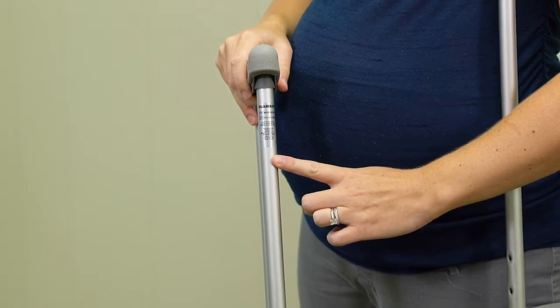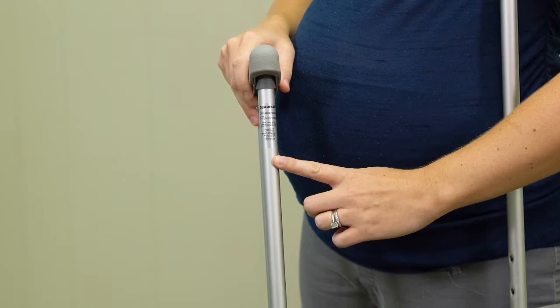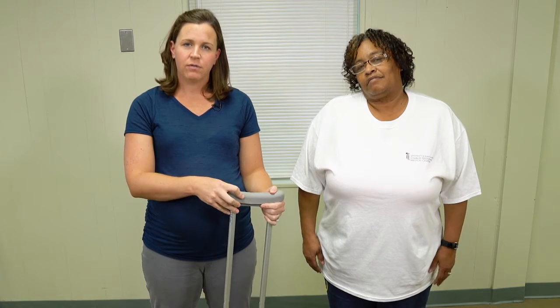Your healthcare provider will help you choose the proper size crutch and help get you fitted. So it's very important to get the crutches sized properly for each patient. If you are the patient adjusting them for yourself, the caregiver adjusting it for the patient, or a healthcare provider adjusting it for a patient, it can be very, very easily done. Ask the patient how tall they are.